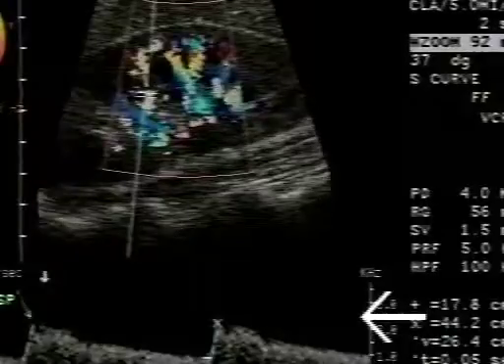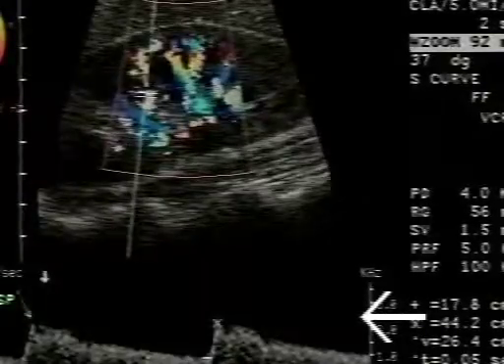As with all aspects of ultrasound, the renal artery examination is a very complex examination. It has a fairly long learning curve to it. The only thing that you can do is basically try to get as many people in to perform the exam on as you can. And the more patients that you do, you'll see that the time it takes you to do the examination will begin to decrease. Your proficiency and your confidence level will increase, and your accuracy will also increase over time.